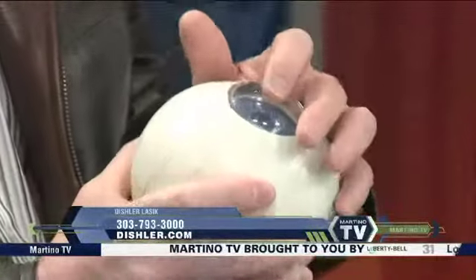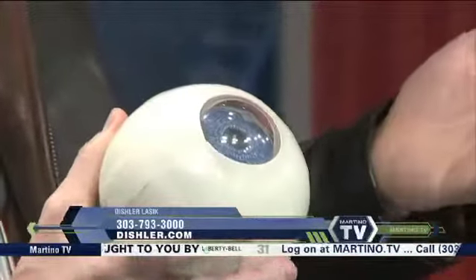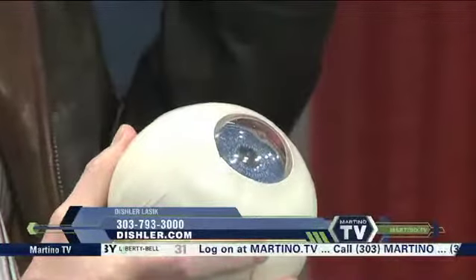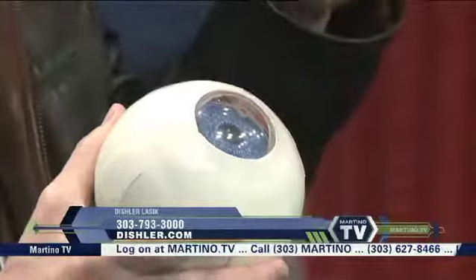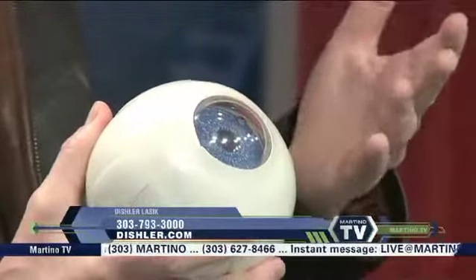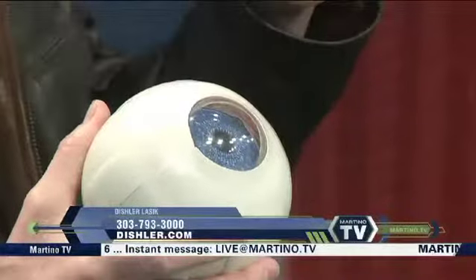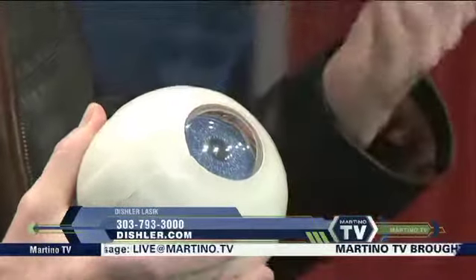It just goes in one eye, and it's kind of like monovision, which we've been doing for years. It only goes in one eye. So the other eye is maintained for distance, and this eye is for near. It's kind of like monovision, but better than monovision, because you can still see great far away. So it doesn't mess up the far away, but helps with the near.